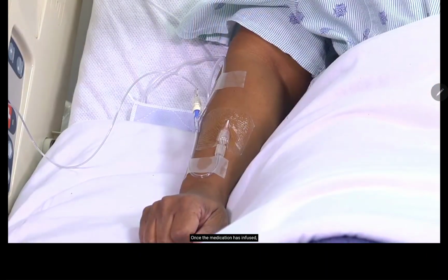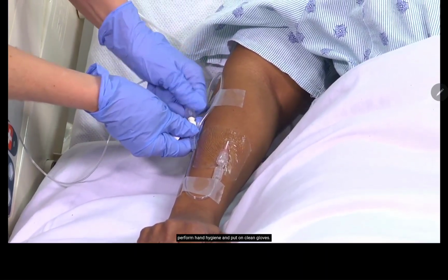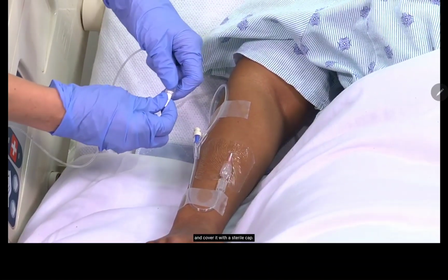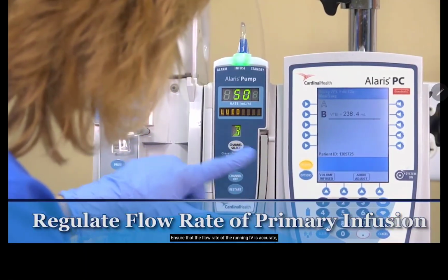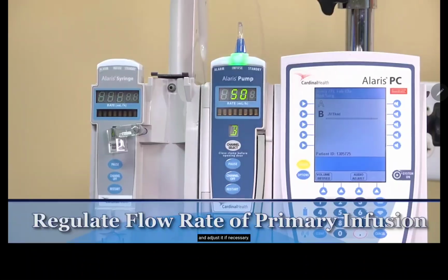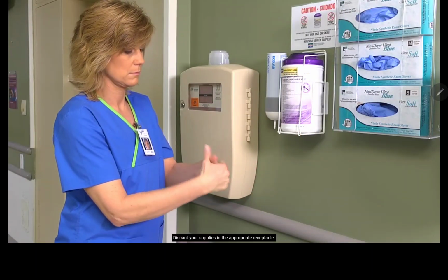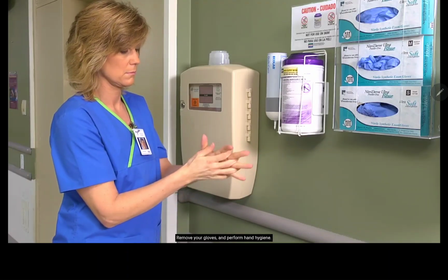Once the medication has infused, perform hand hygiene and put on clean gloves. Remove the mini infusion pump tubing and cover it with a sterile cap. Ensure that the flow rate of the running IV is accurate and adjust it if necessary. Discard your supplies in the appropriate receptacle. Remove your gloves and perform hand hygiene.